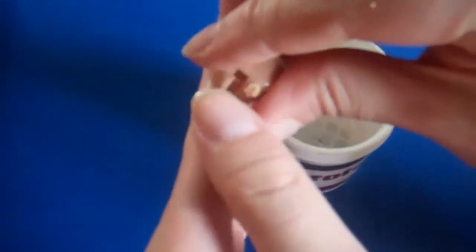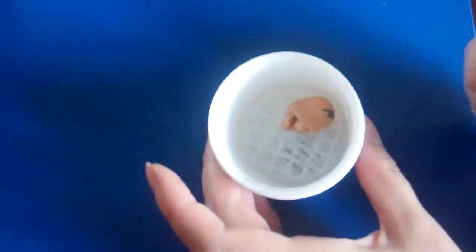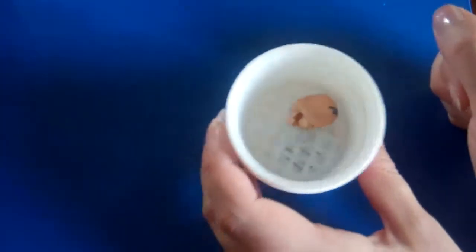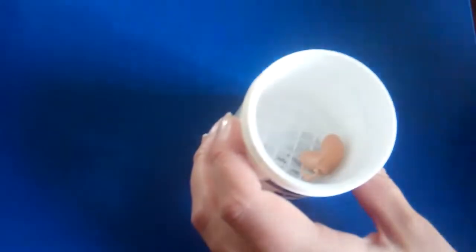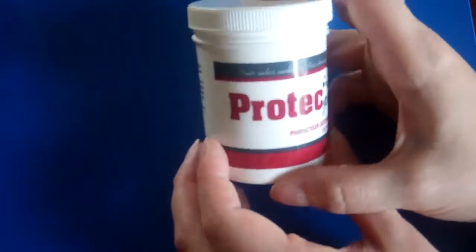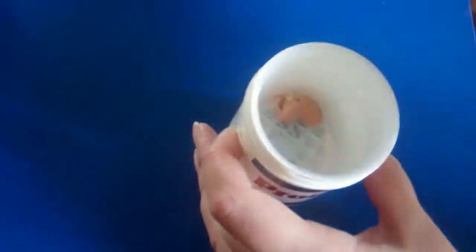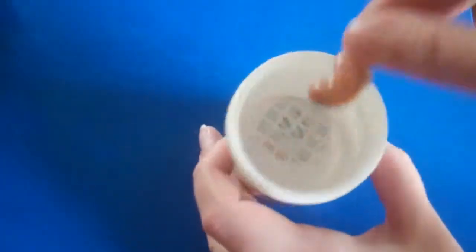You open the battery door of your hearing aid so we can dry out the components inside, and you place your hearing aid inside like so. You just put the lid on top and you leave it like that overnight. This is to ensure that your hearing aid consistently works over time and doesn't succumb to moisture issues.